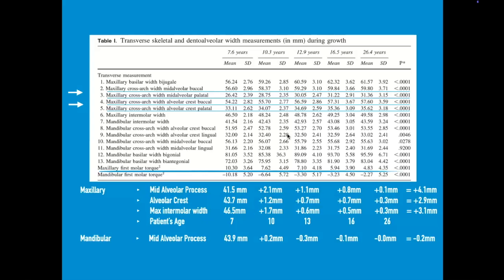But here's the thing, and this is where it becomes challenging, that is such a loaded question, right? Because there's so many different types of expanders. Every patient is not the same. The resistance between the sutures is not the same. The anchorage, the amount of roots on the baby teeth versus the permanent teeth. In this case, you can see she's already lost one of the primary teeth, so that's less anchorage on one side compared to the other. Hopefully one day we will have a very predictable formula for the exact type of expander we need and the amount of turns we need to affect the exact skeletal change that we're looking for. But right now, by and large, we do the best that we can and we guess.